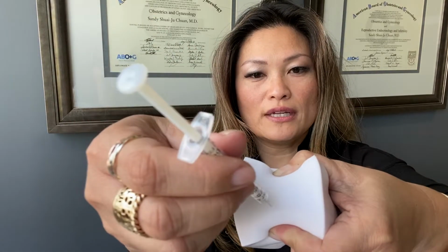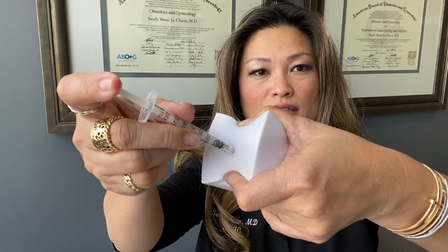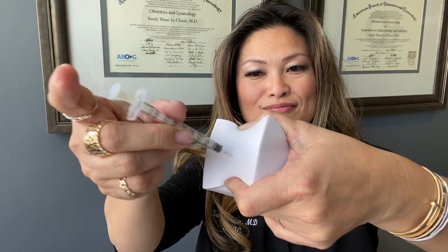That might feel really, really cold, but honestly, it can be helpful in minimizing the sensation of the prick. Then you would take your first injection, and let's say this is the Gonal-F, okay? You just hold it and squeeze it, then go straight in and push, and that's it, you're done. Then throw that directly into your sharps container. You don't need that anymore, okay?